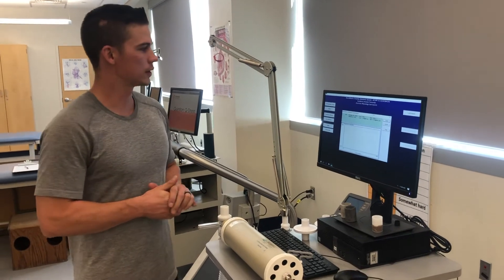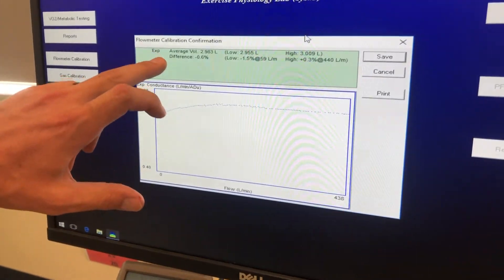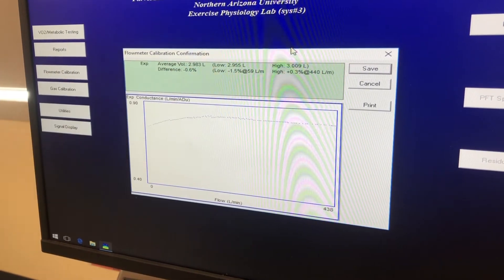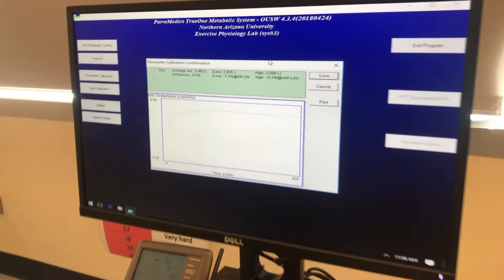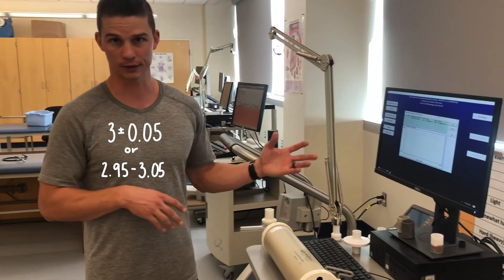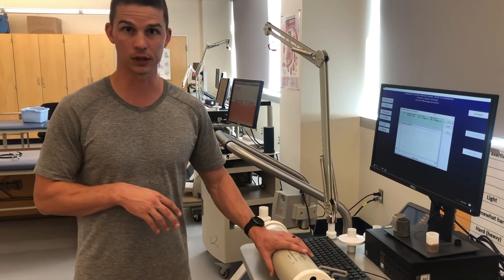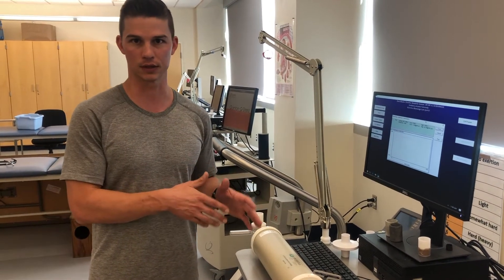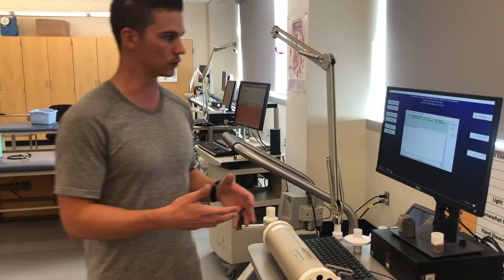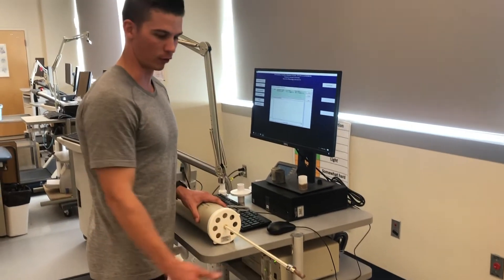After completing the calibration, a results window pops up. The average volume is the value we want to look for — in this case 2.983 liters. We want that value to be between 2.95 and 3.05, so plus or minus 50 milliliters, because this is a 3-liter syringe. One thing to keep in mind: you want to pull all the way out before you push in.